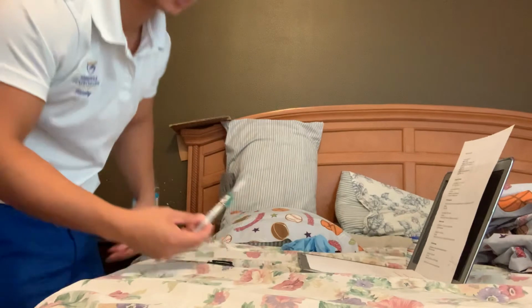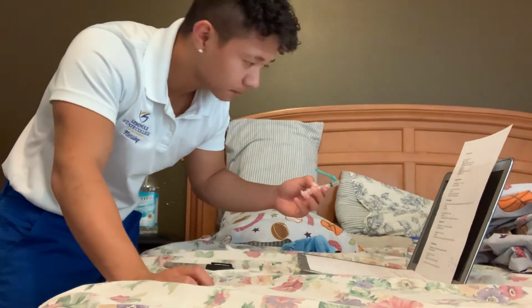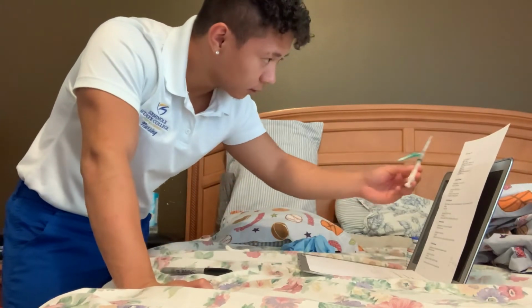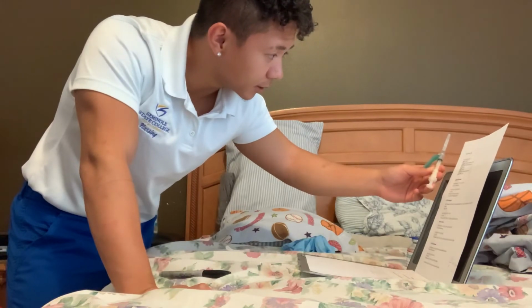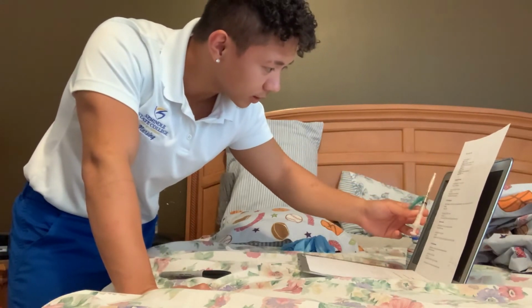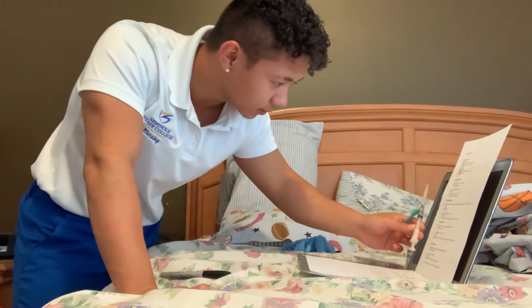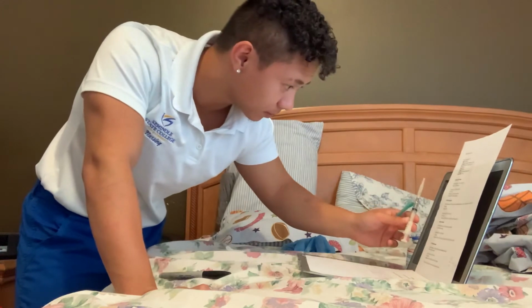So I've labeled the syringe, and now I'm just going to do my third check. So compared to the MAR, right patient Anna Pawlowski, influenza vaccine, 0.5 milliliters, IM at 14:58, and I have the right documentation.